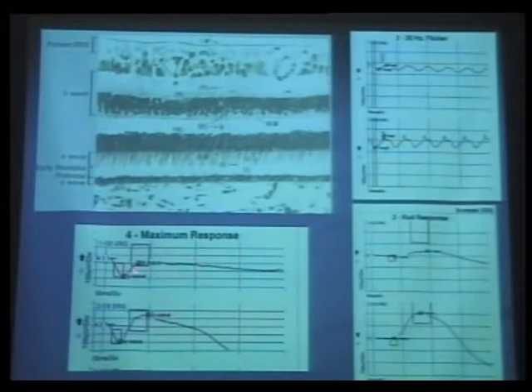This was his ERG response in the periphery. And there's the A wave, there's no B wave, as compared to the normal eye. And when we did the flicker, here's his flicker in the normal eye, and there's some cone response that came through. And this was his single flash, which was pretty low grade, compared to his rod response in the right eye compared to his rod response in the left. But the flicker showed us something. That's more than a count fingers flicker response.